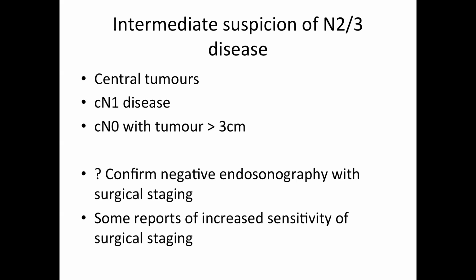The tumor that's very large, even if you don't have enlarged lymph nodes, they might have N2 disease, a better capture rate if we are doing mediastinoscopy. So those are a few patients where it's going to make a big difference to the outcome, perhaps taking the whole patient into account with their fitness, trying to work out, are we really doing the right thing by offering a potentially curative thoracotomy on this patient or not? We want to know what we're dealing with. It's often better to do the mediastinoscopy early on.